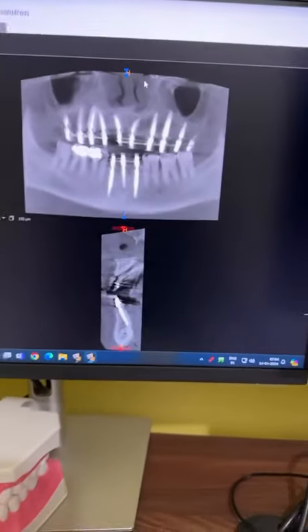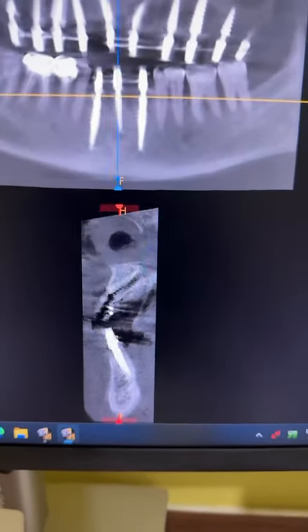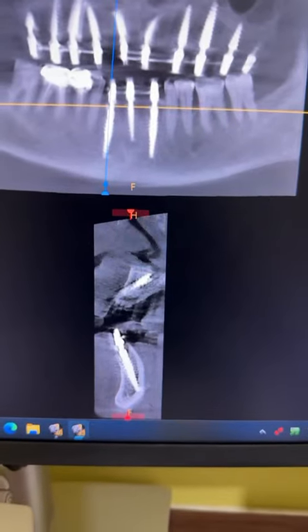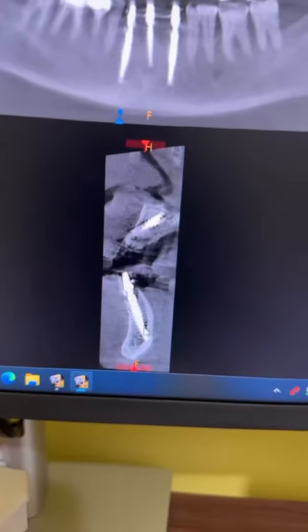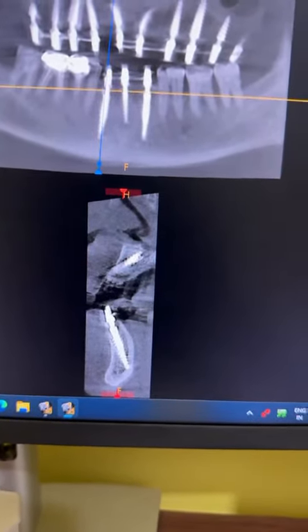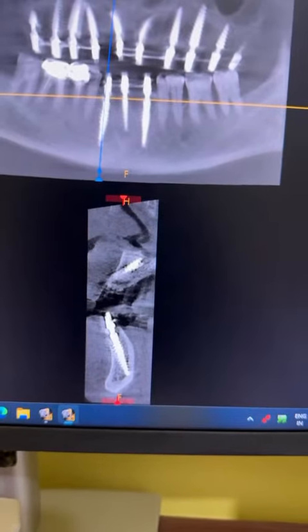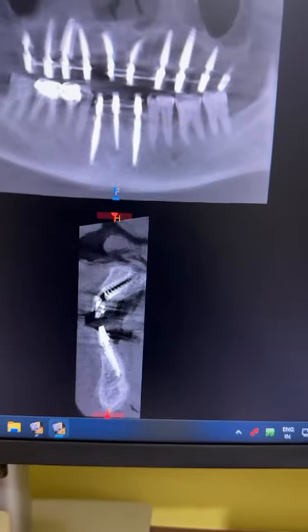We will see the post-op. On the right side we have used VCCx. Going till the lingual cortical plate, we should not perforate it. This is a 17mm VCCx smooth surface implant.